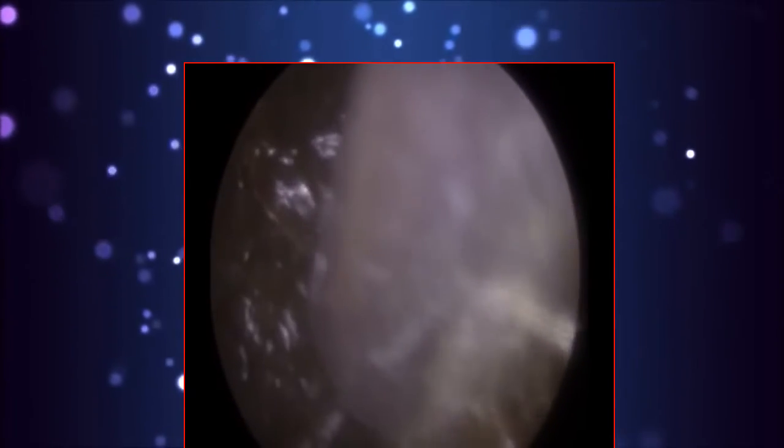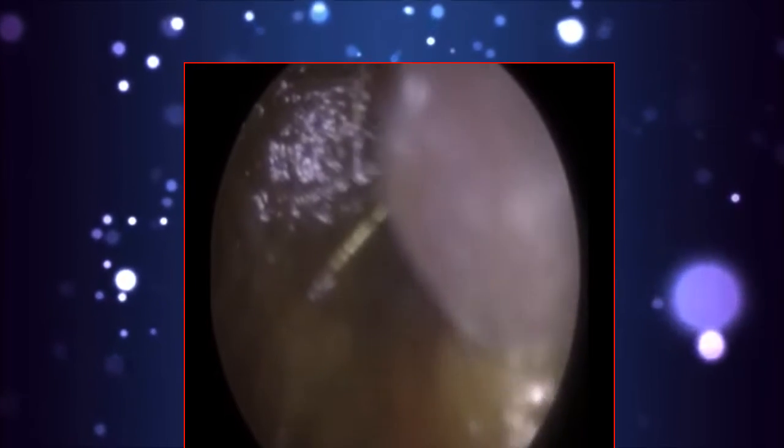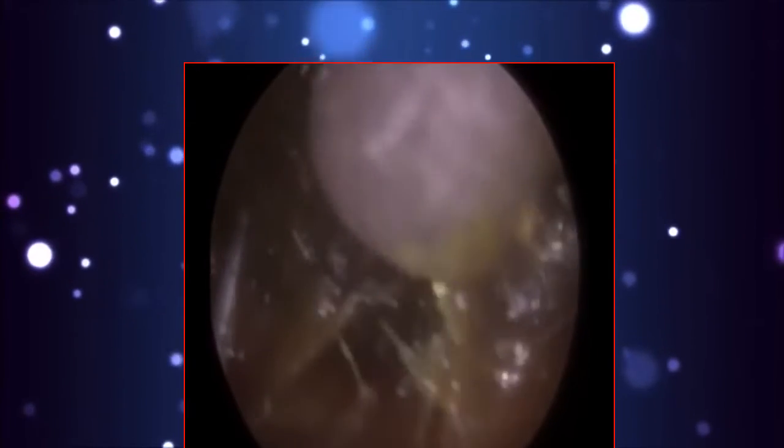So I've decided to do a quick compilation of 3 patients today. This is the first patient and this is the patient's right ear. And you can see the wax is quite glutinous, it's quite sticky.